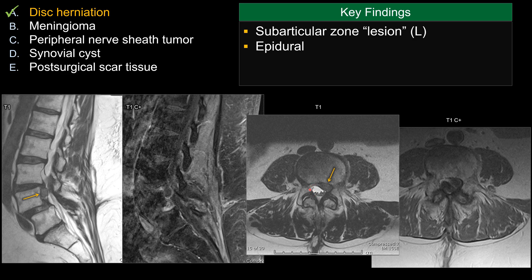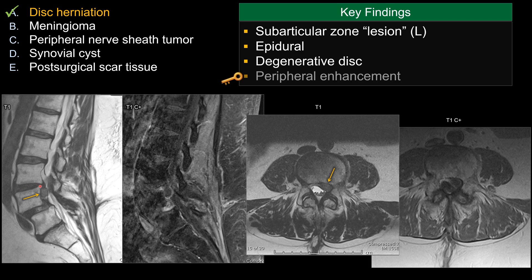The nerve root is widely open in the lateral recess on the right side. On the left side, the nerve root has been compressed. Also, there's a degenerative disc one level above at L3-4. The disc is dehydrated or desiccated. The most important feature is the way the lesion enhances. The enhancement pattern is peripheral rim enhancement on the sagittal view and also on the post-contrast axial view.